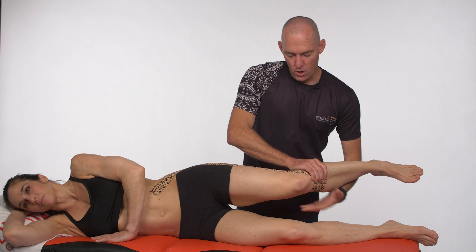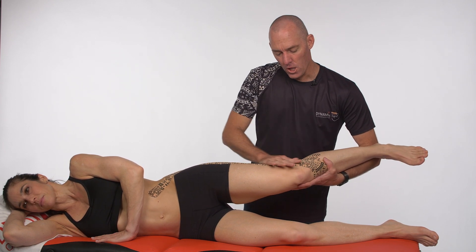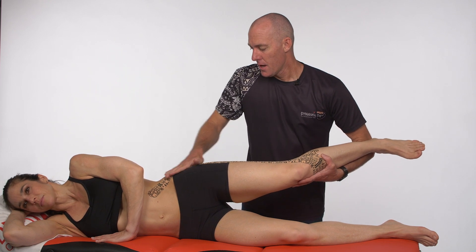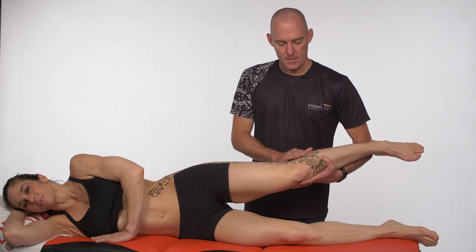Come and give it a nice hold, particularly where the tape crosses. In any hollow areas, you may want to use the spray to maximize your adhesion. Then good holding on the end for 30 seconds to a minute to maximize that bonding.